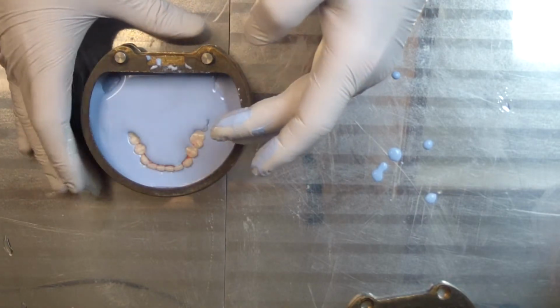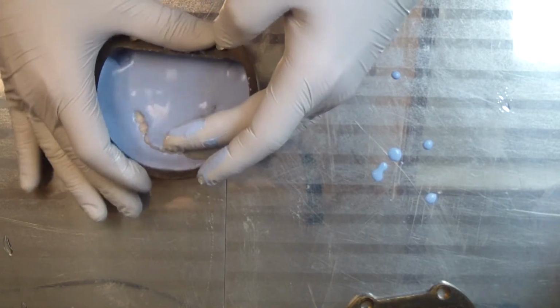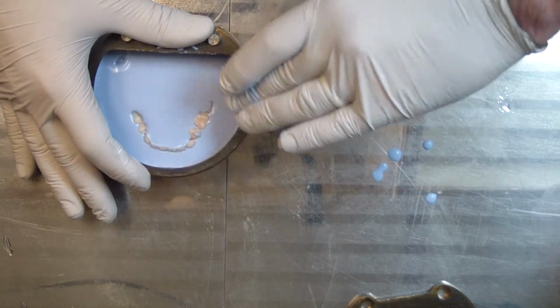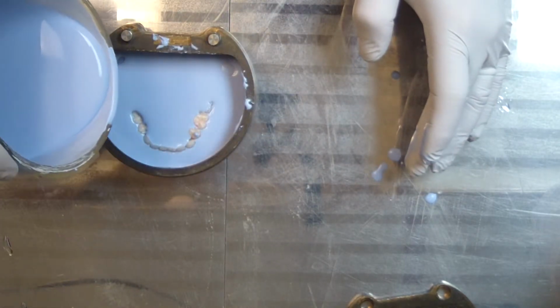What I'll do at this point is I'll shake the flask a little bit, make sure everything gets into the embrasures and incorporates everything really nicely. And I'll add a little bit more.